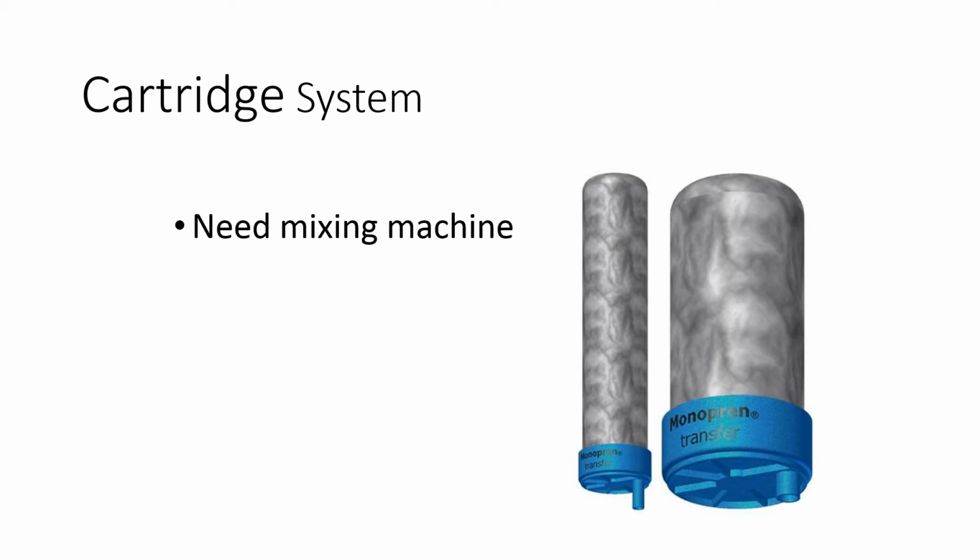Should that happen, it will be necessary to retake the entire impression. You cannot accurately reposition the quick transfer into an impression if it's been displaced. So in this situation you must clean the quick transfer, remove the impression material from the vents, reposition and take the impression again.